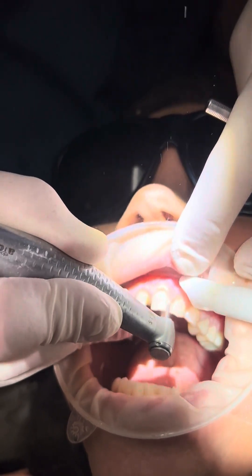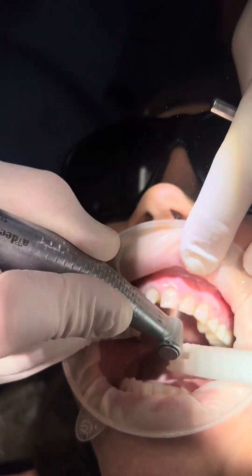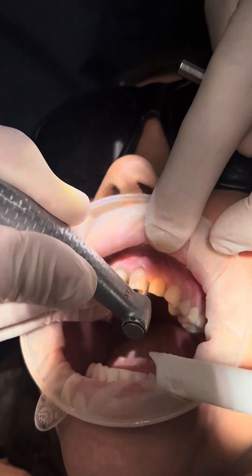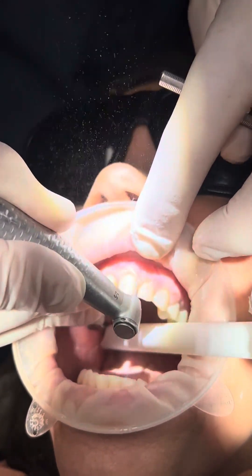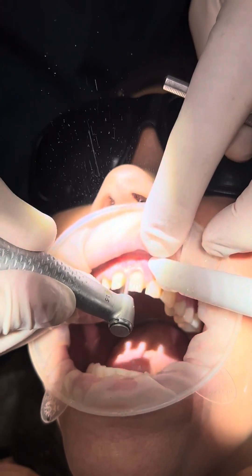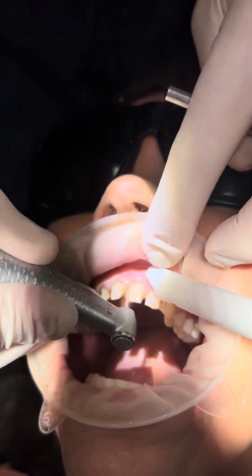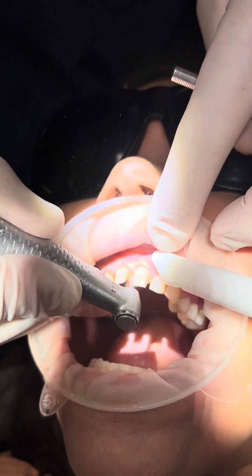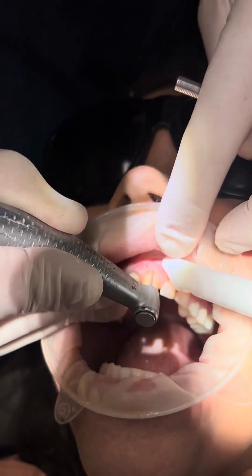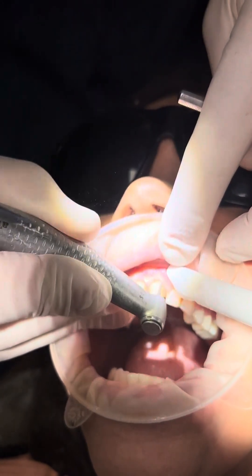Now we're going to go and do our interproximal check. This is an AM6 bur. I'm coming in from the mesial and doing our interproximal check here, going pretty much up with the gingival margin. Now we're connecting the mesial to the buccal, creating our chamfer.